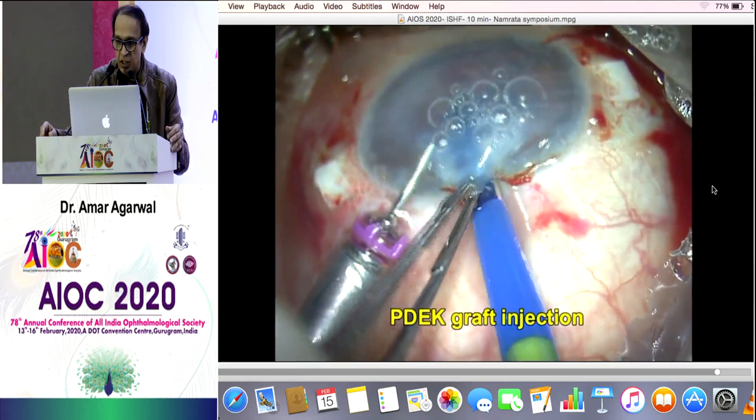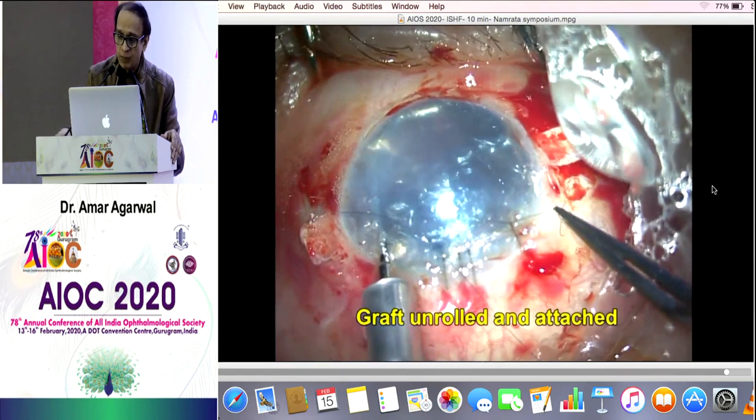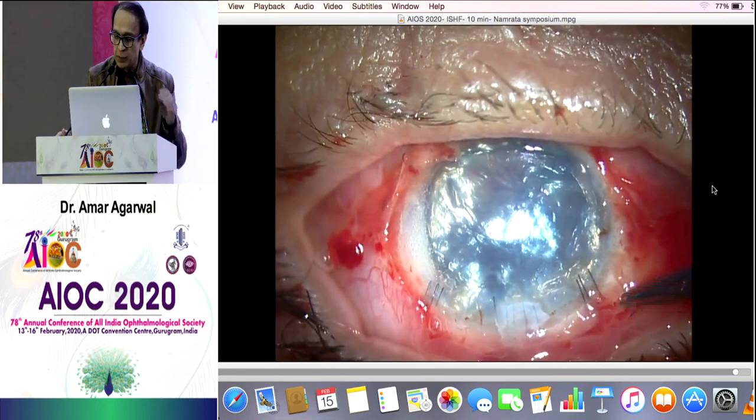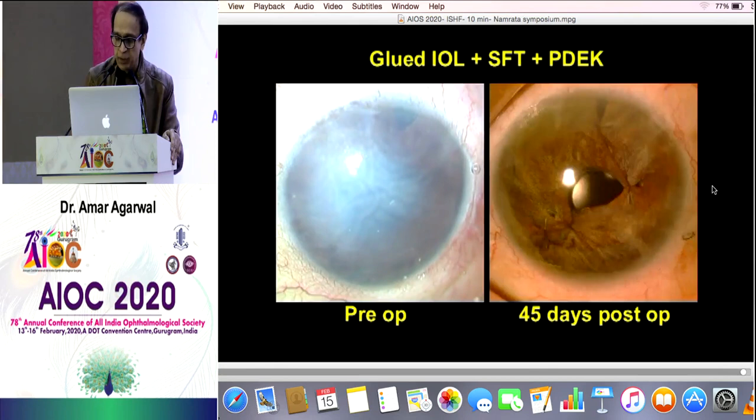And as I just said, for completion's sake, let's see how this patient looked at the end after intrascleral haptic fixation, where we have done the glue, we did the vitrectomy, we did the pupilloplasty, and ended it with PDEK. You see the fibrin glue being applied, sealing everything down, and the last clipping, which I'm just showing you in the last 10 seconds, that's preoperative, ladies and gentlemen. Six times operated, came from Bombay: preoperative, postoperative, 15 days post-op, and the final picture, which we will show you now, is 45 days post-op, and you can see the massive difference from the pre-op to the post-op. Thank you very much.